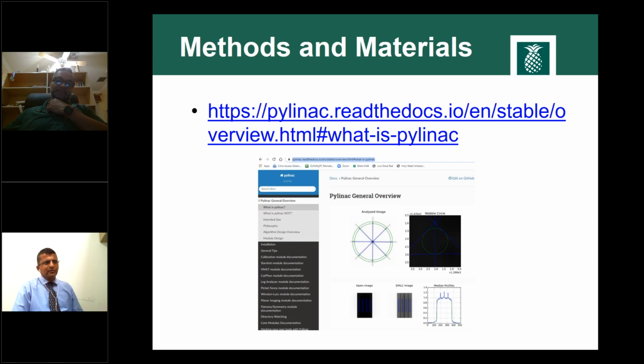You can use a web-based interface, and they have all their documentation there, and there is a forum discussing all these questions. Okay, and we can keep the server in our hospital, without keeping any of the data to the provider, I mean the software vendor. Yes, you can actually simply use their web interface and save the data into your local drive.